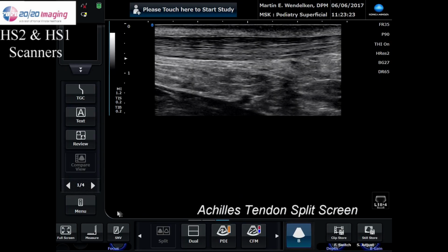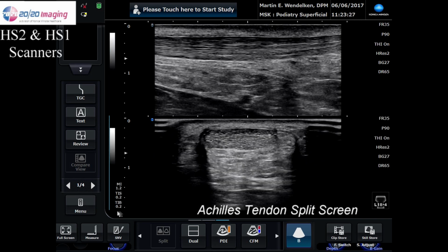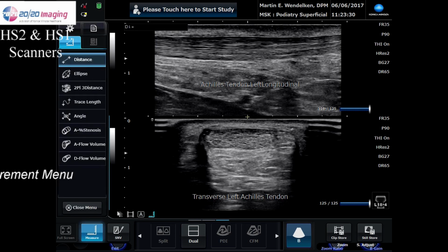Okay, we're going to now take advantage once again of the split screen so we can see the longitudinal and the transverse on the same screen. Something a little bit different this time. We're going to now show you the measurement menu after they're labeled. So if you look on the left, this is now the measurement menu. You have your choice of distance, ellipse, and tracing, and all the different functions that become available when that menu's open.